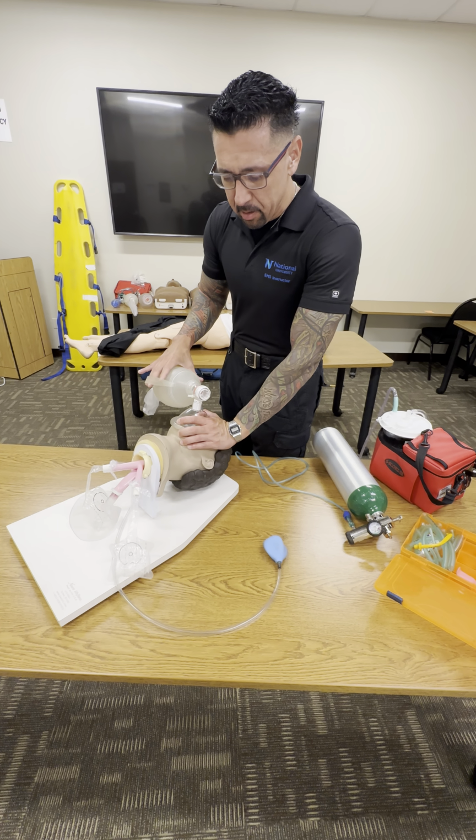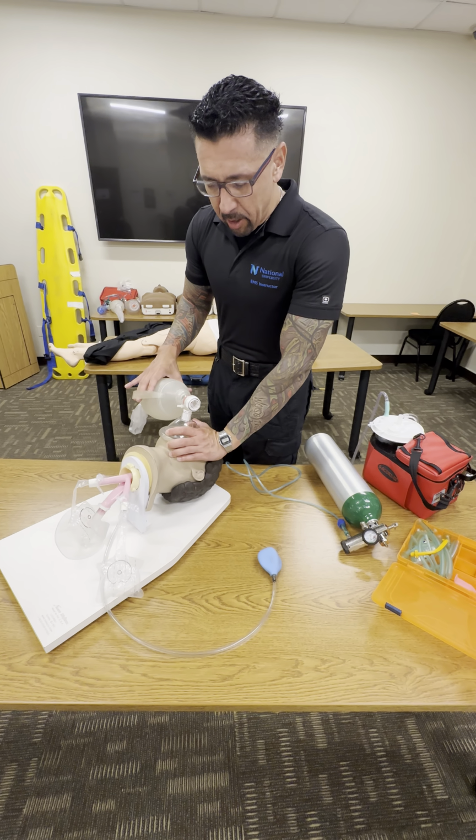Breathe. How would you know if you are delivering appropriate volumes with each ventilation? Adequate chest rise and fall.